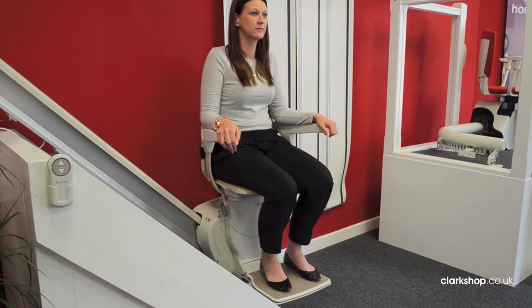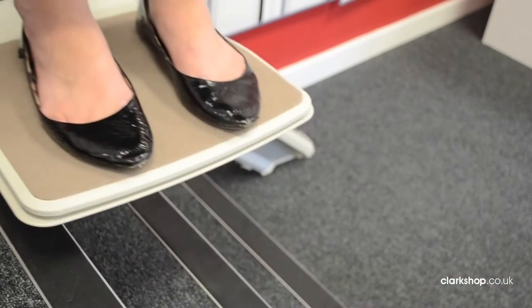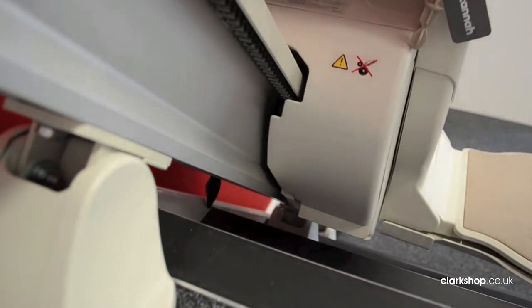A stairlift helps you regain access to your entire house and is very simple to operate. Here we show you how to use a straight Stannah stairlift. The operation however is similar for all stairlift options that Clark & Partners provide.